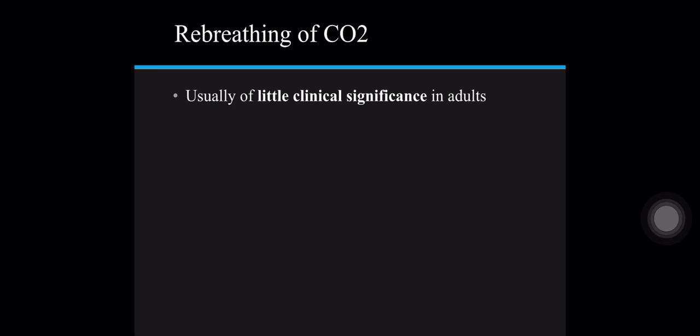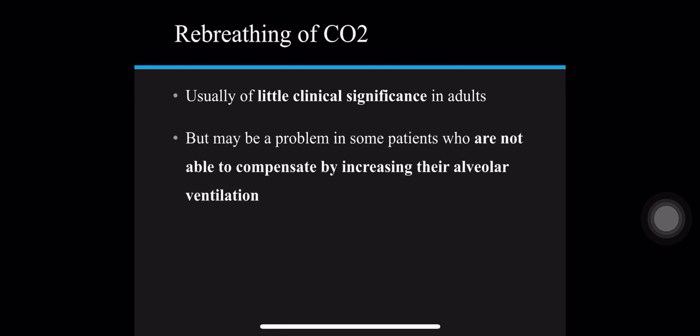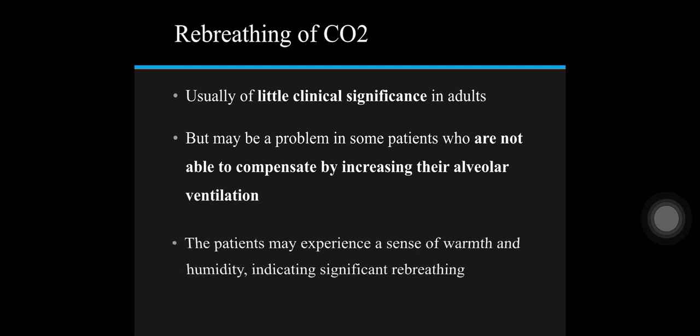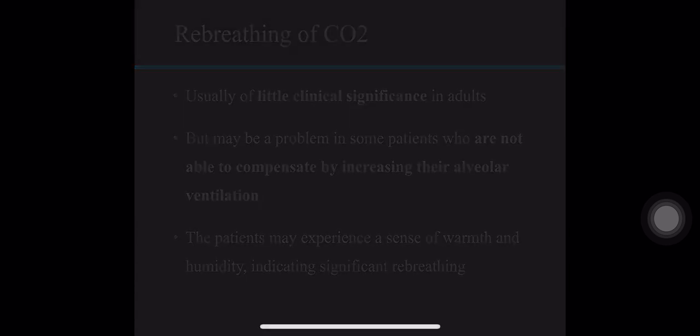Actually, rebreathing is usually of little clinical significance in adults, but it may be a problem in patients who cannot compensate by increasing their alveolar ventilation, for example patients with chronic lung disease. If rebreathing occurs, the patient may experience a sense of warmth and humidity. Carbon dioxide elimination can be improved by increasing the fresh oxygen flow.